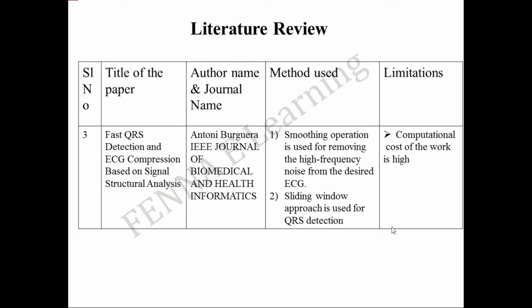In the third paper, the method used is a smoothing operation to remove the high frequency noise from the desired signal. Then a sliding window approach is used for QRS detection. The major limitation of the work is that the computational cost of the work is high.